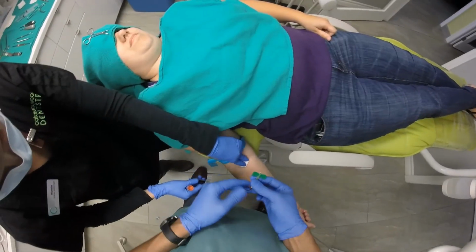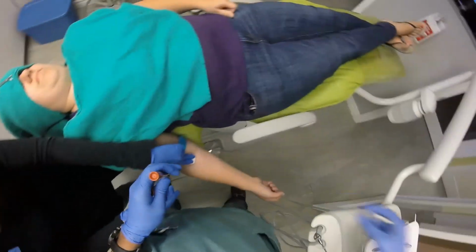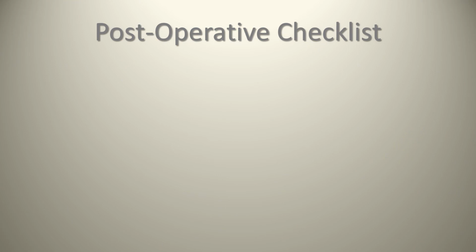In this sort of case, which I find a lot easier, you have to keep a steady hand with that needle and vacutainer holder apparatus, and you'll see us pop another bottle in here, and there you go. Once again, we're getting a nice draw. So this is the second video for venipuncture, and in this second video, you can see I'm wearing gloves.